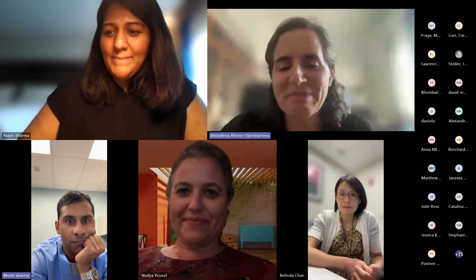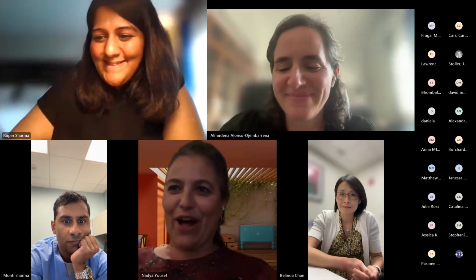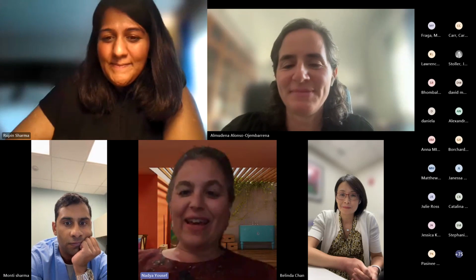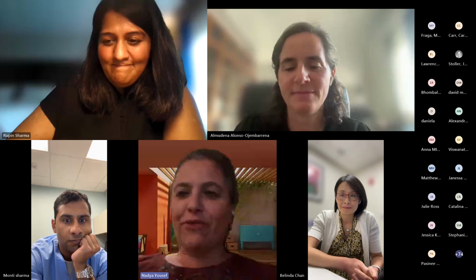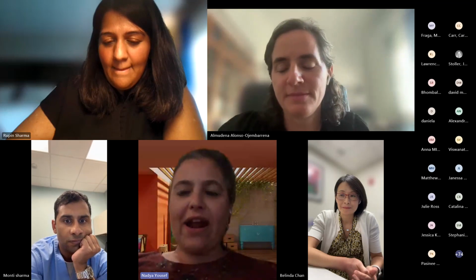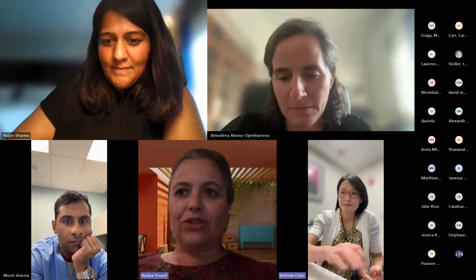Nadia, please go ahead. I'll go first, and hello everyone. First of all, thank you, Almudena. It was brilliant. I really learned a lot from your talk. We are actually not using the SF ratio.